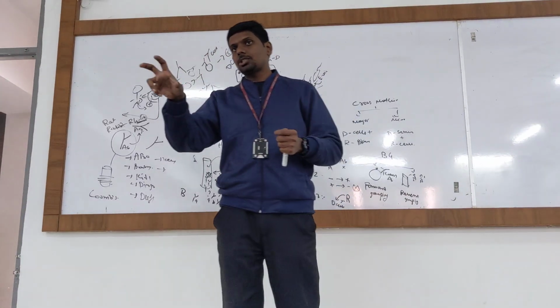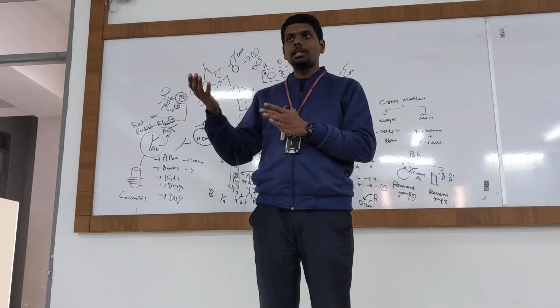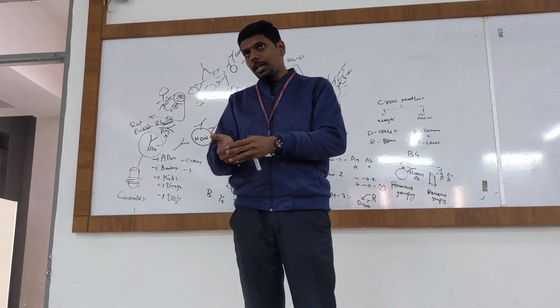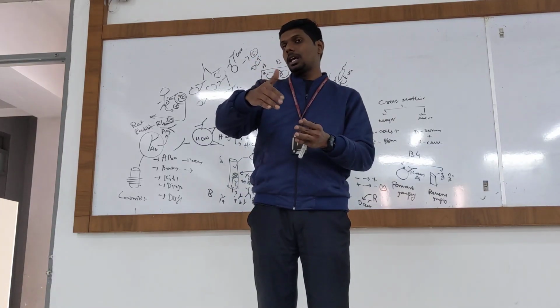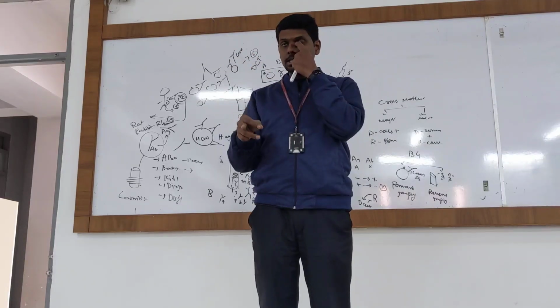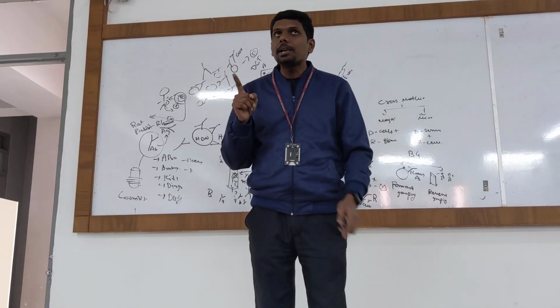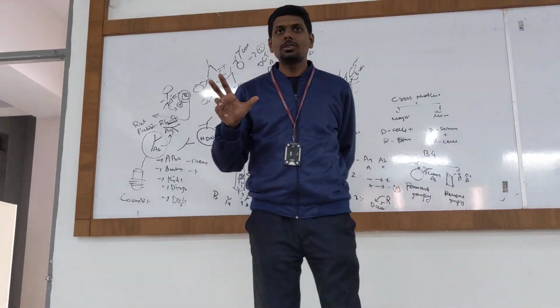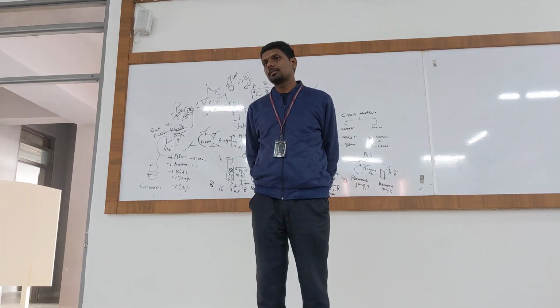Sometimes these blood packs are cold in temperature. We need to bring them to room temperature. When we are not bringing them to room temperature and we transfuse them to the patient, there might be either acute or delayed reactions. That is due to these temperature variations and antibody reactions. You just go through the material, you will understand. So that is cold agglutination. That is the reason. Next question.